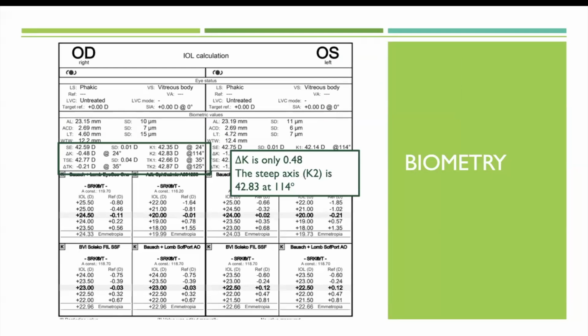Now, where this is relevant, it's probably less relevant now, but people used to use this, and sometimes people still do, in terms of choosing where to sit on the eye. With the newer keratomes, with the newer types of surgery, where our keratomes are only 2.2, 2.4 millimeters, most people will tell you that a section that's only 2.2 millimeters wide is not really changing the K values of your cornea. But when those corneal sections used to be 3 or 4 millimeters, they definitely were. And that's where all of this is coming from.